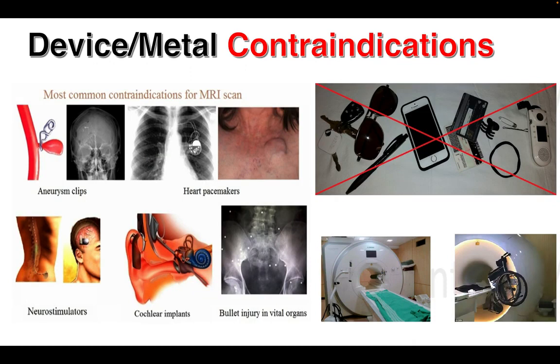Magnetic devices, electrodes, and metallic implants are a great challenge within the MR environment. Due to the nature of the strong static magnetic field and resulting ferromagnetic interactions, an object or device may be moved, rotated, dislodged, or even accelerated toward the magnet.